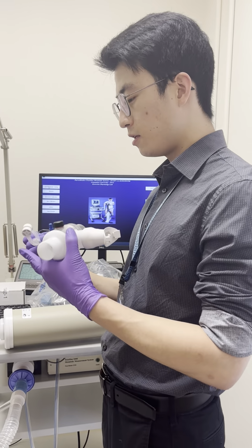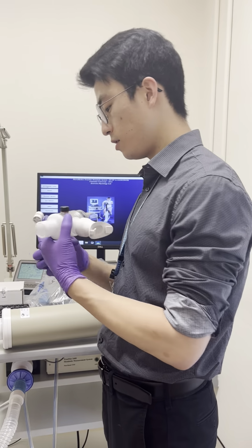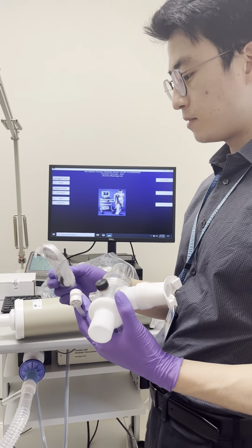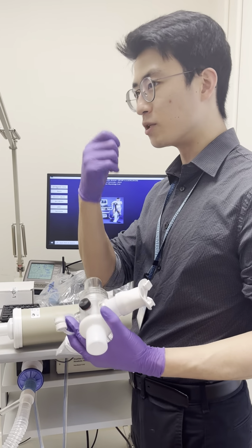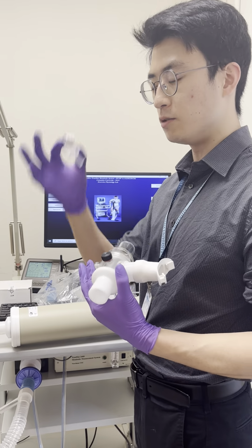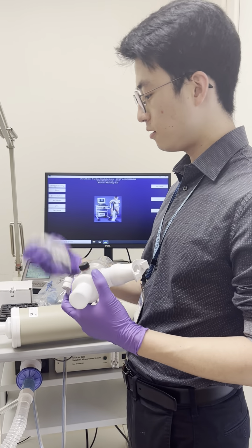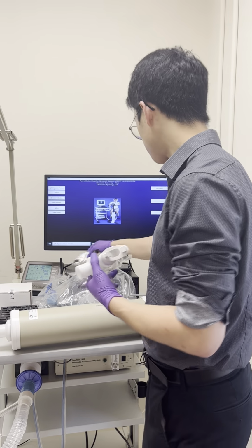I personally like this a little better because you need 2 hands, but this, you just need 1 hand. And then I also brought you a couple of heavy-duty backups. Some people just have larger noses, or some people have more slippery noses, or it might be kind of hard to use this. So in those cases, use the heavy-duty ones. These are disposable. These, just clean them with alcohol and use them a few times.